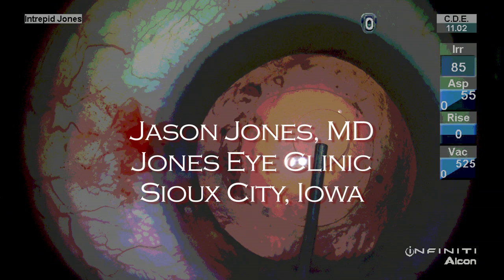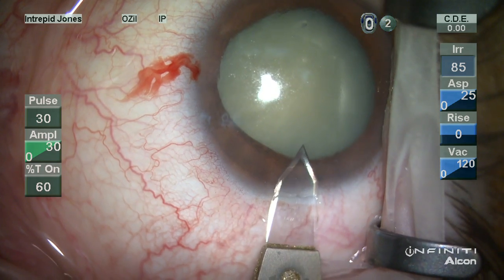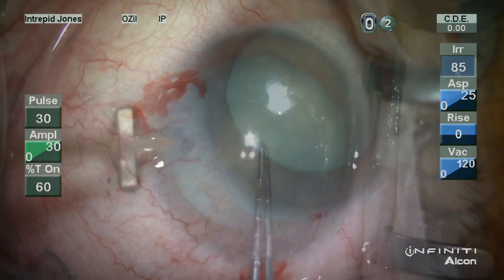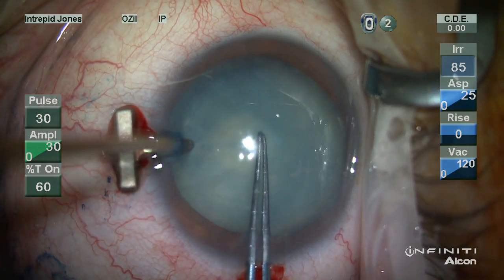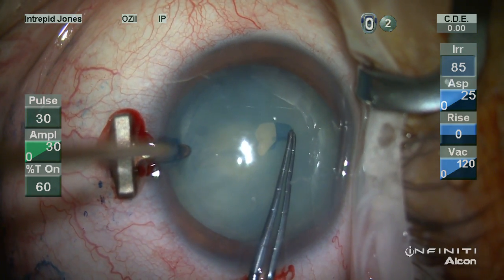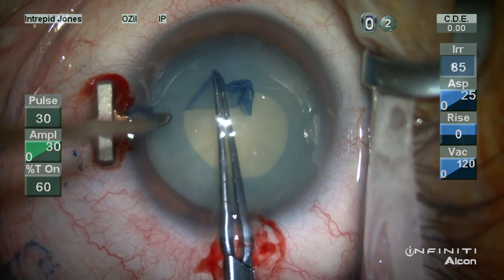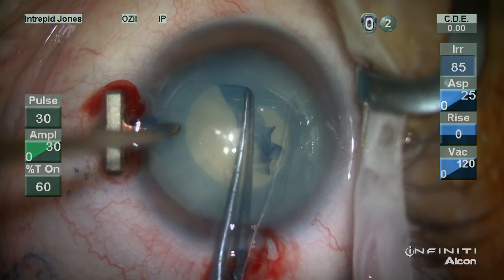One of the challenges of a patient with a white cataract or significant posterior subcapsular opacity is residual posterior capsular plaque. This is true in this patient here as well, and I've developed several elements that I've used to resolve these issues in a very efficient way.